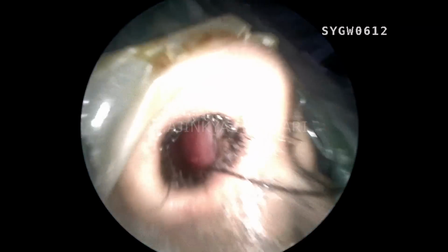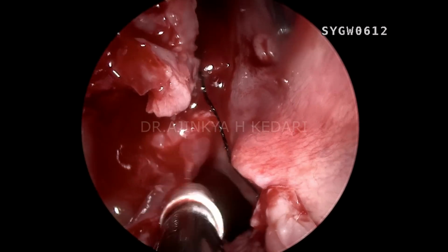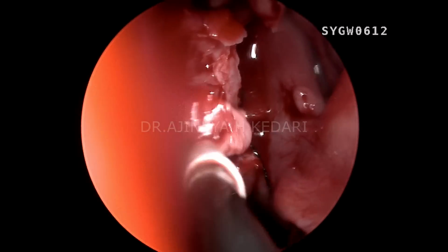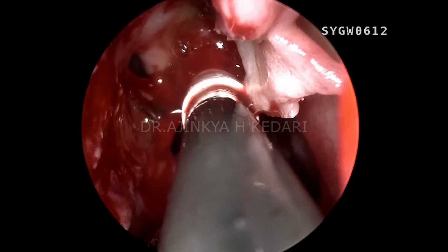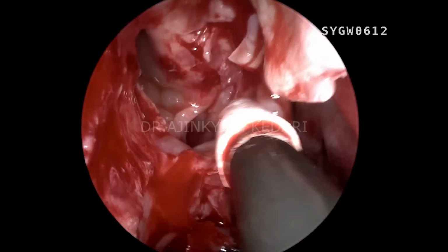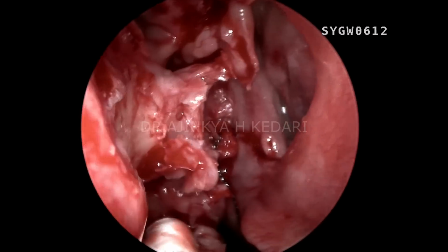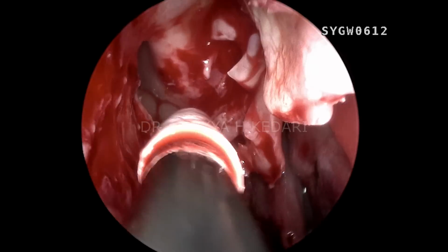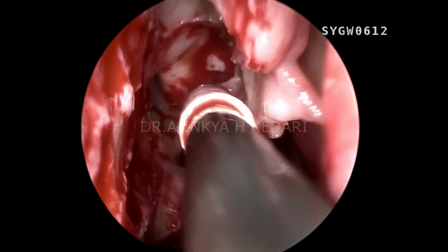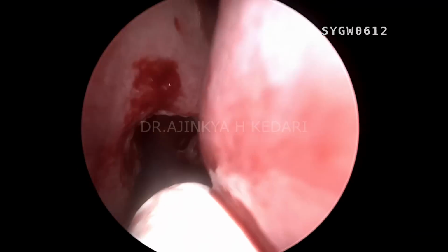Otherwise, you're going to injure the sphenopalatine branch to the middle turbinate, and that's going to cause a lot of bleeding. So the trick to avoid that is to cut the stump a little ahead, so that you avoid lacerating the artery. So you can see I've taken off that middle turbinate, and I'll later keep that same middle turbinate in normal saline, preserve that tissue, and may use that middle turbinate mucosa as a free fascia graft.